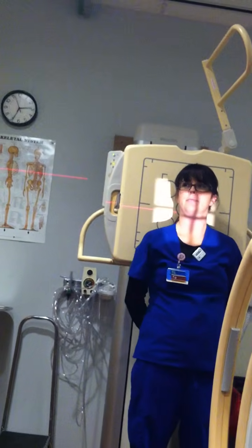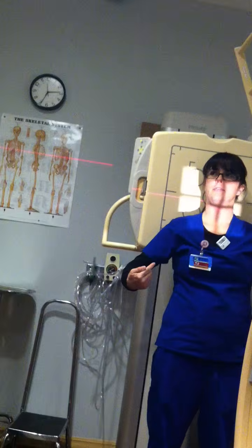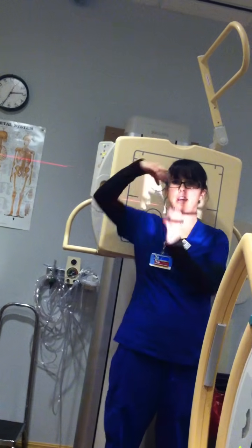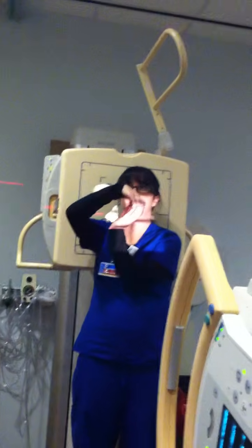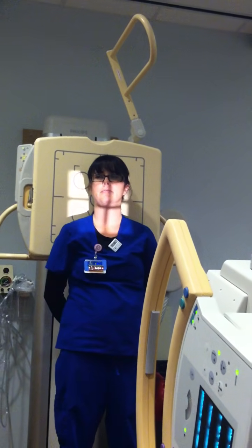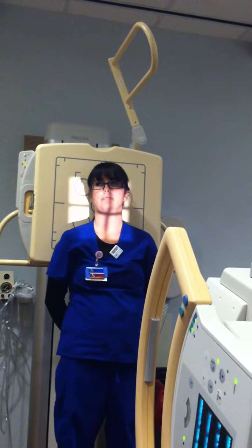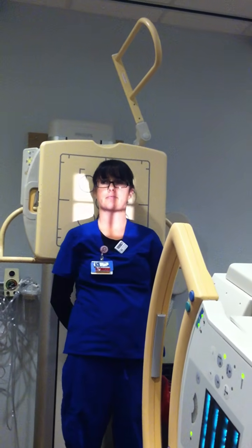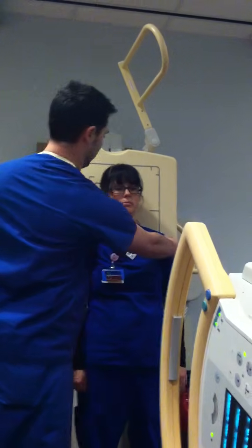What are we looking up to see your intervertebral foramen? The transverse process. So we're kind of looking right up the transverse process, and we see the inferior notch and the superior notch, above and below the pedicle, and that's where our foramen sit on that angle. Everything in the cervical spine hangs down, right? So we have to angle up to see them. To look up the transverse process, you need an angle.